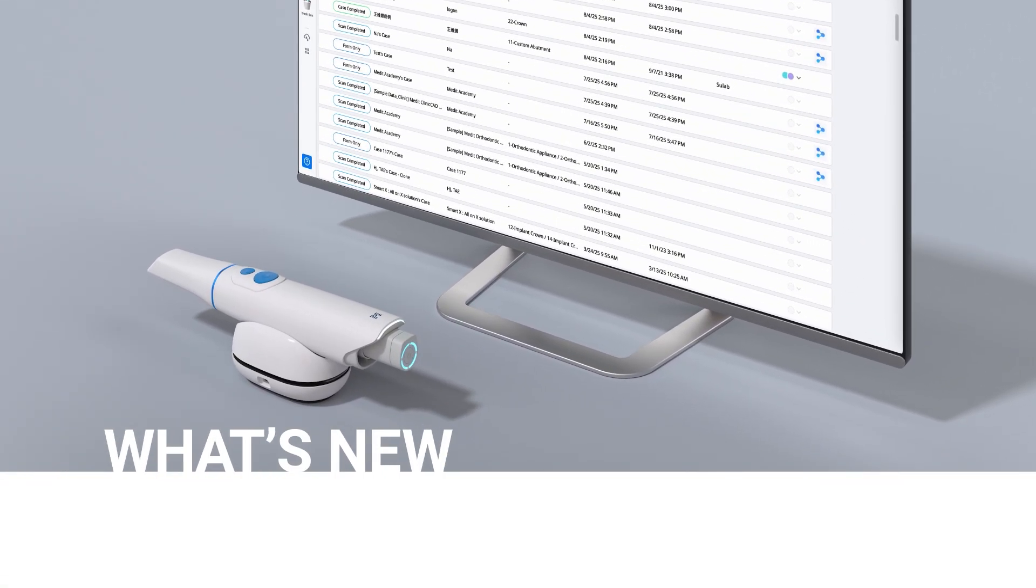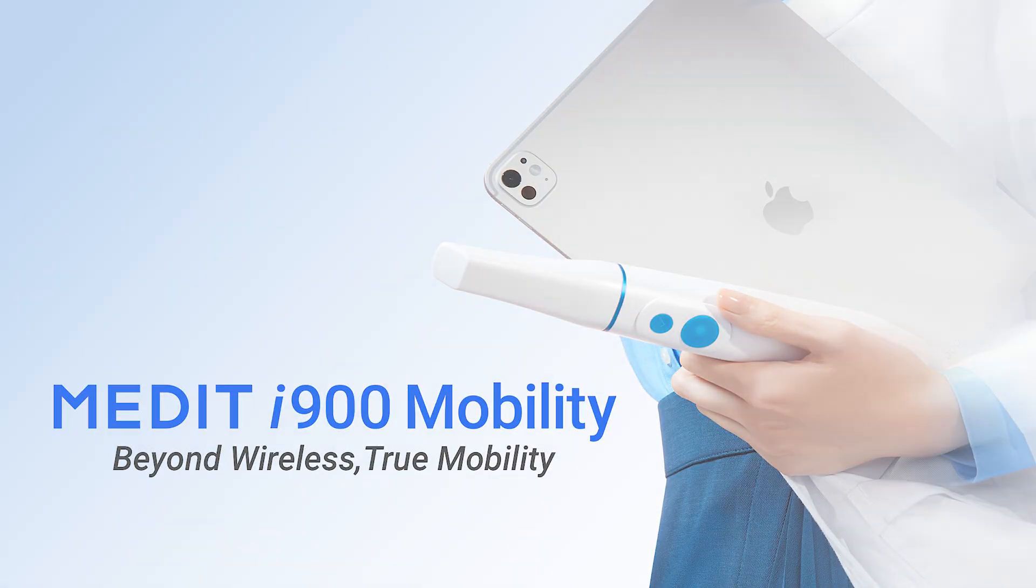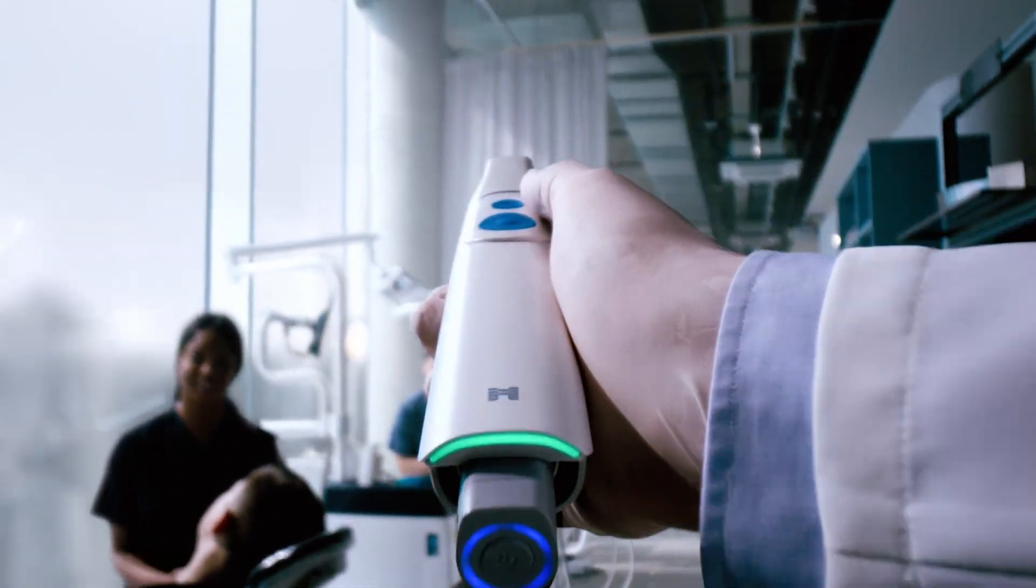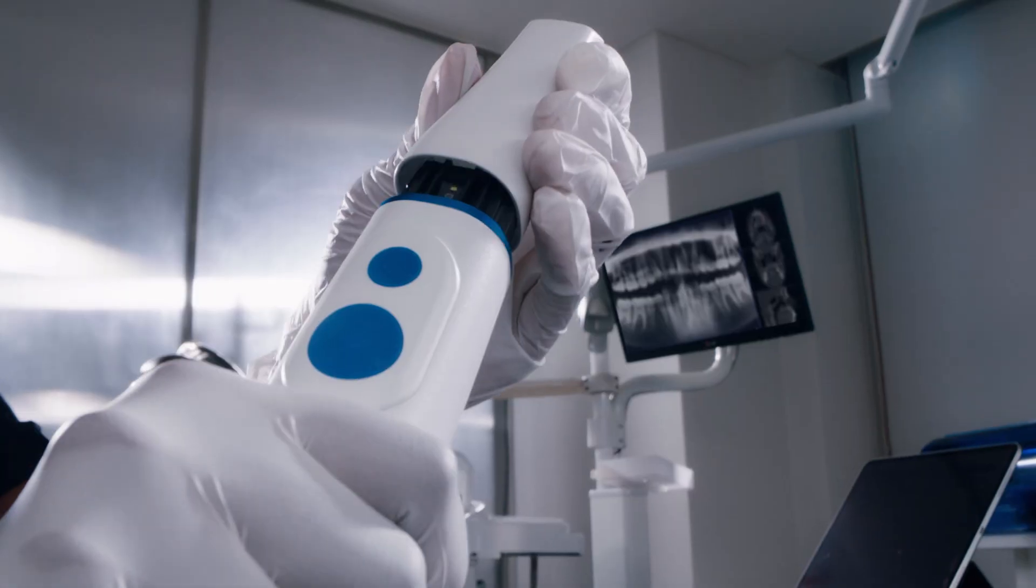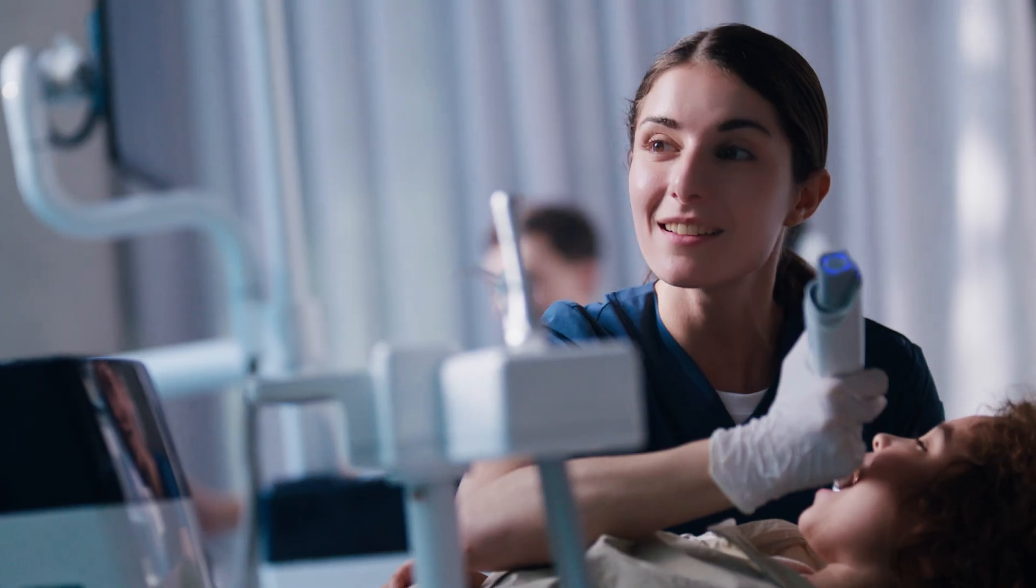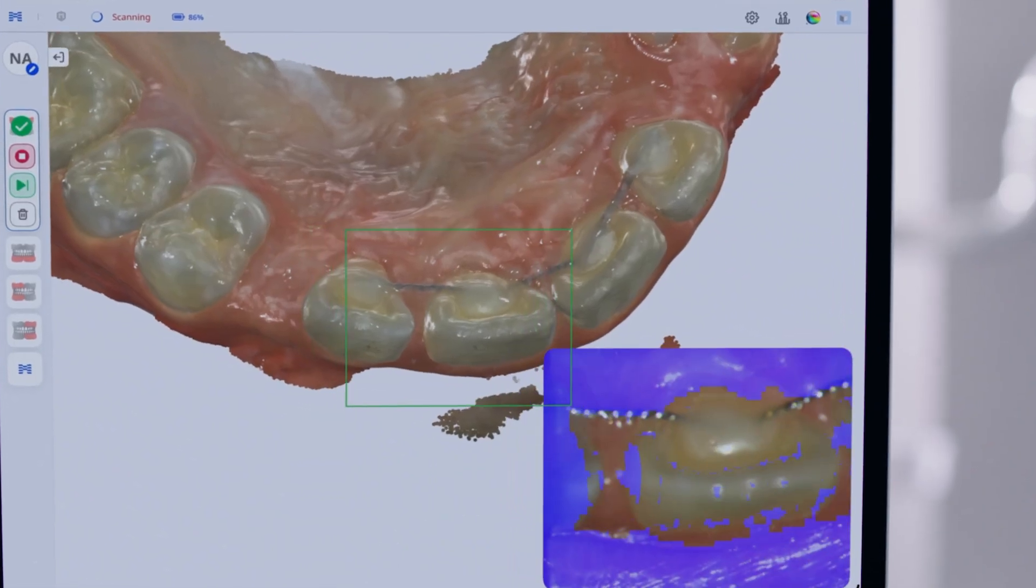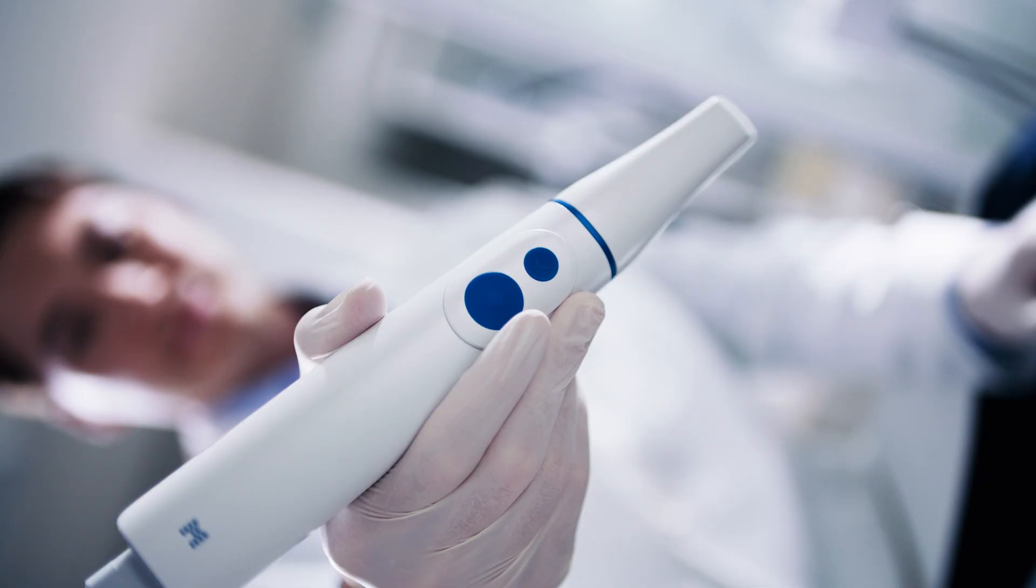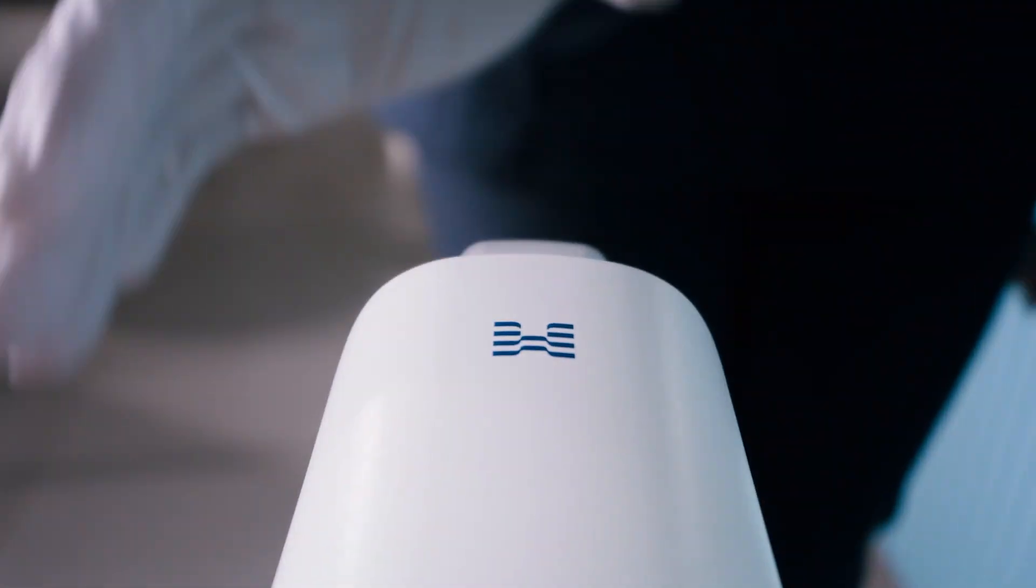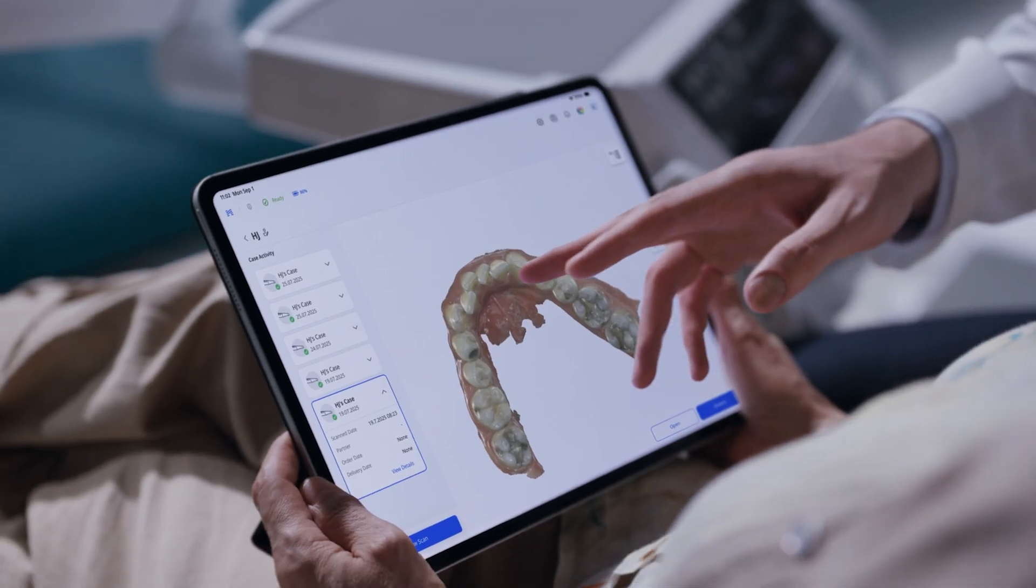Discover what's new in MeditLink 3.4.5. Introducing the newest member of the i900 family, the i900 Mobility. With Medit's third-generation optical technology, you can achieve even more precise scans and connect wirelessly through your clinic's Wi-Fi router or hub with ease. Learn more at Medit.com.